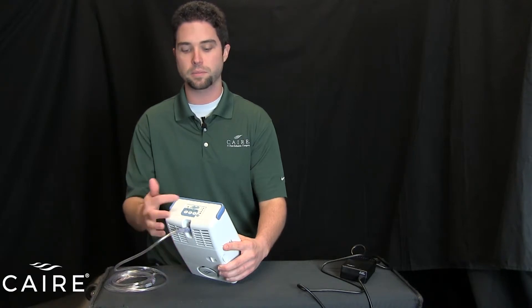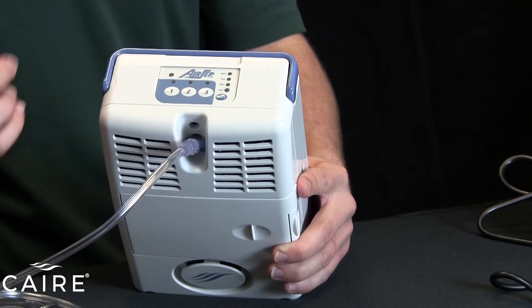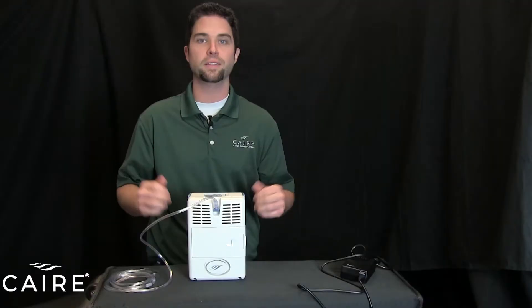To turn the device off, press the button that is currently illuminated for the flow rate you're using. So in this case, press number two to turn it off. And that's it — that's all there is to operating the AirSep Freestyle.